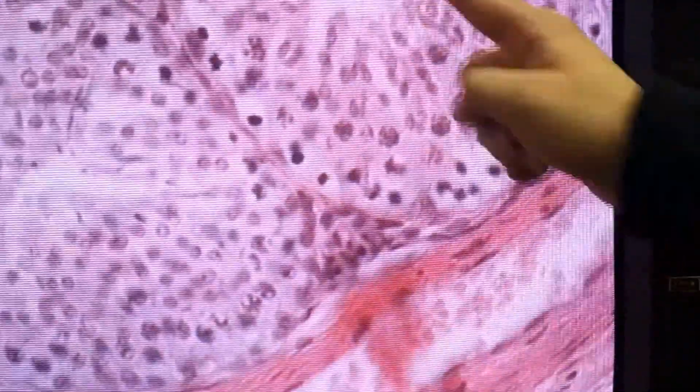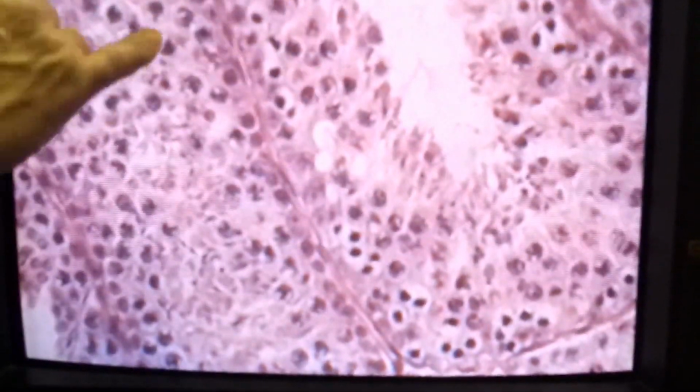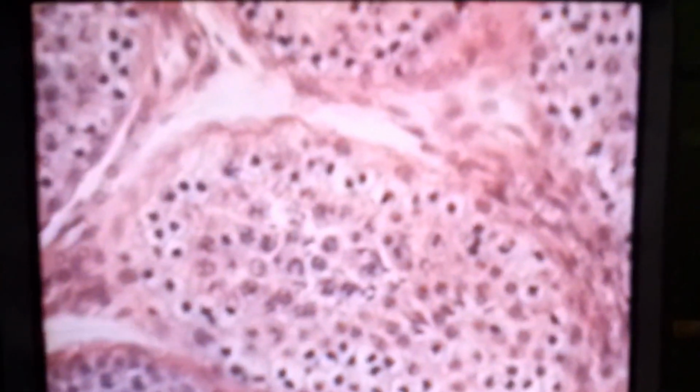Does the sperm push towards the middle of the lumen? It doesn't really push anywhere. It grows toward the middle as it's attached to a Sertoli cell. And some of these elongated cells are myoepithelial cells, so there is actually some contractility to move the lumen contents toward the epididymis. There is a net movement of fluid so that the sperm, as they mature and detach from the Sertoli cell, are washed out toward the epididymis. They can't use their flagella yet. That doesn't happen until they're in the epididymis.